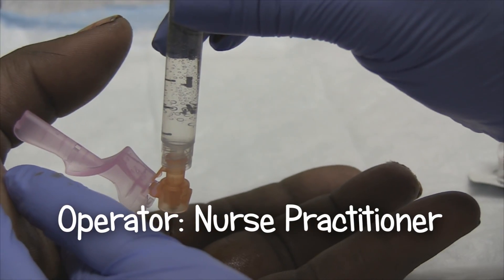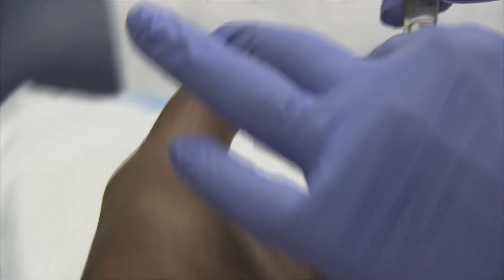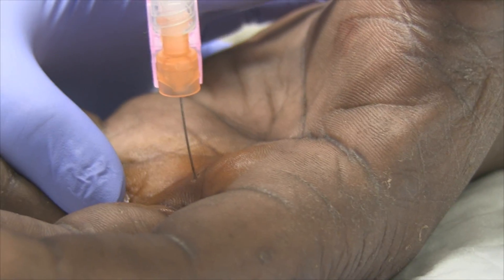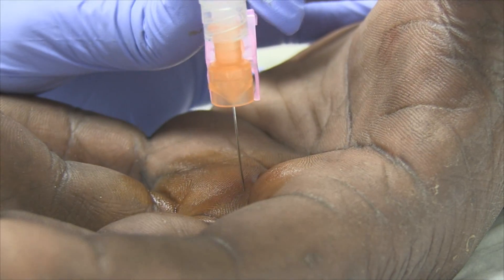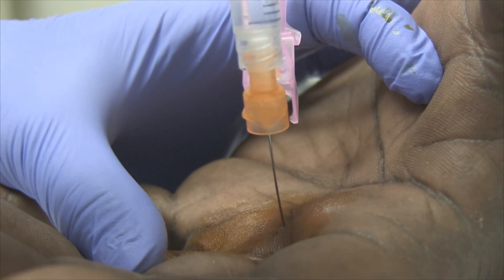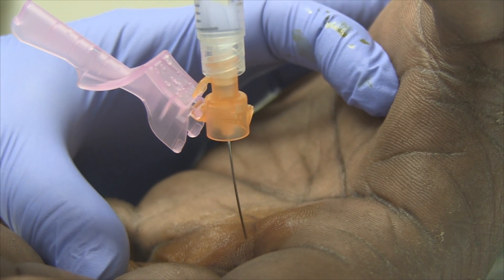Big breath, here we go. Hold still, relax. Perfect. We're just going to be putting some in, okay? You're doing good. You pulled back just a little bit — you came back off bone? Yes, went down, touched bone, came back. Is it flowing in pretty easily? Yeah. We've got about one CC in, about another half.